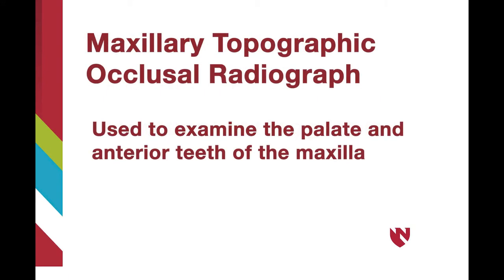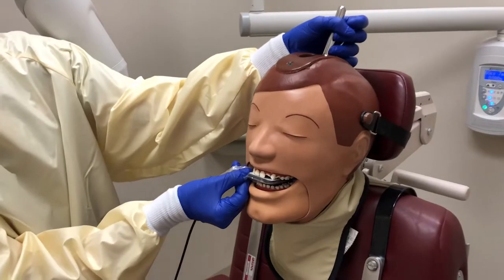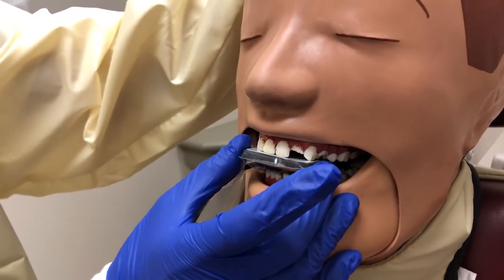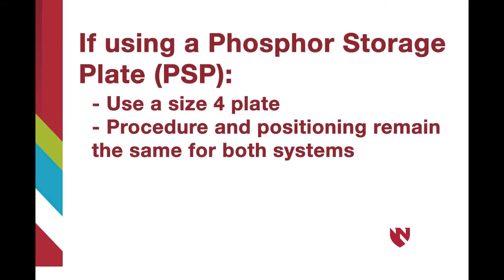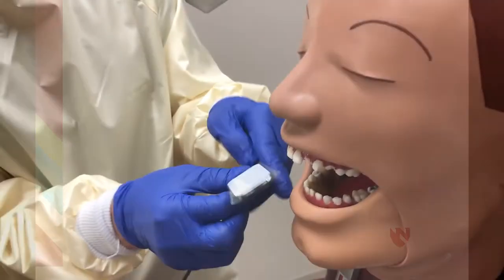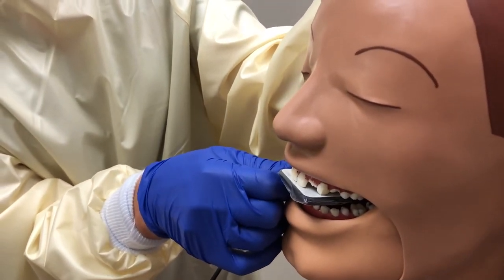The first demonstration will be the maxillary topographic occlusal projection. A maxillary topographic occlusal radiograph is used to examine the palate and anterior teeth of the maxilla. Start by positioning the patient with their maxillary arch parallel to the floor. For adult patients, use a size 2 sensor and place it in the patient's mouth with the tube side facing the maxilla. If you are using phosphor storage plates, a size 4 plate is available for an occlusal radiograph.